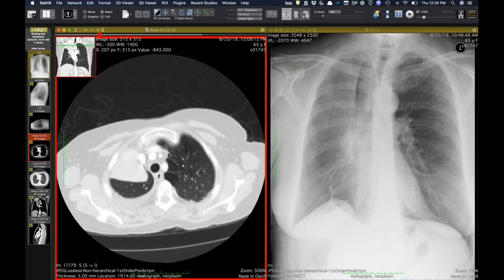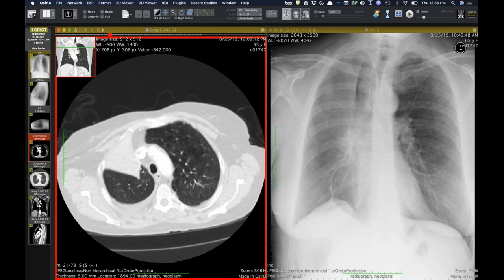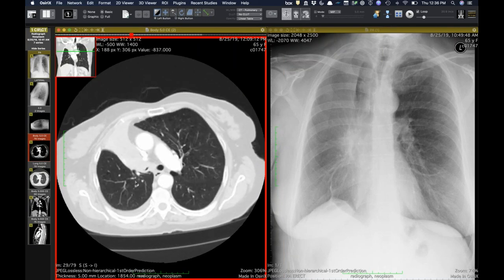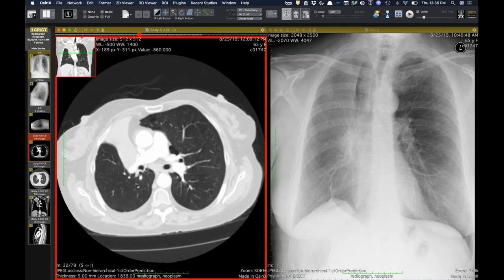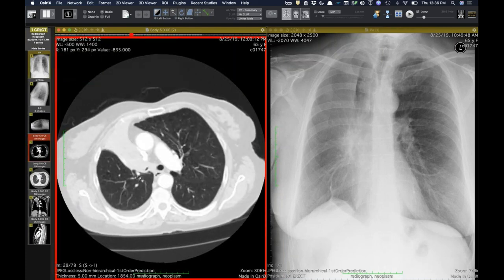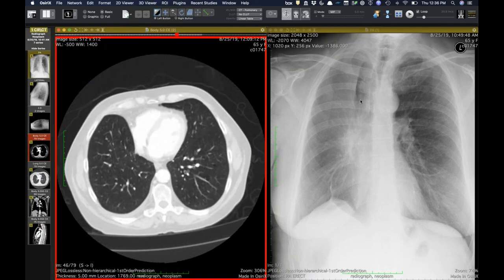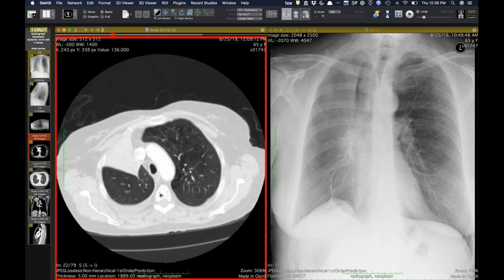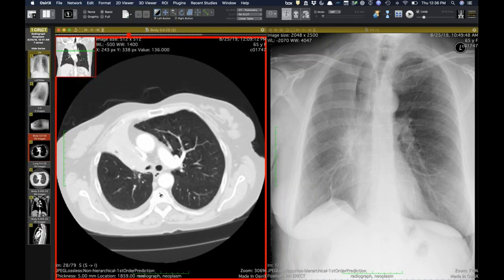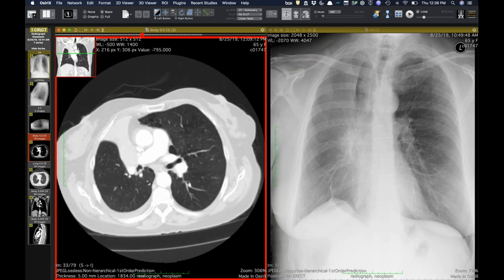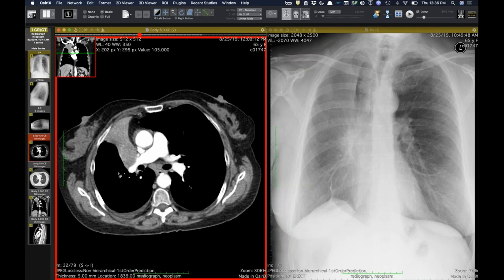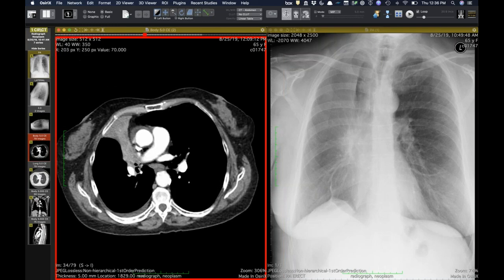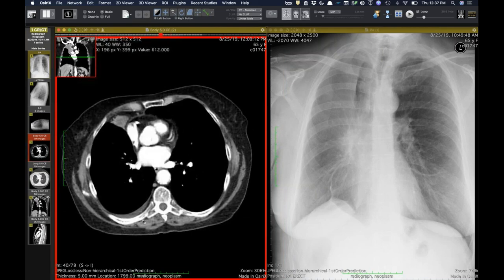So this is the equivalent of the loop sign — what is causing the tenting here? It's from the hilum — this is like the superior segment of the right lower lobe. The cause of the collapse was squamous cell carcinoma. There's tumor in the right upper lobe and lymphadenopathy. Something's knocking out the right middle lobe as well, but sparing the right lower lobe — the bronchus intermedius is okay, and then the right middle lobe bronchus is involved. You have to have two hits to take out both the right middle and upper lobes.